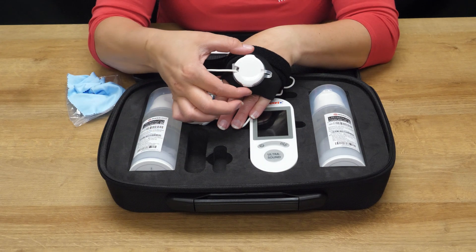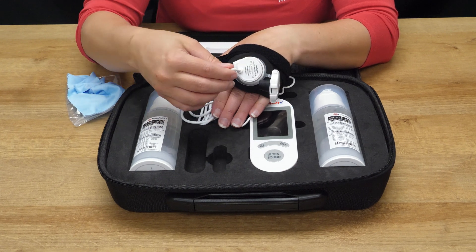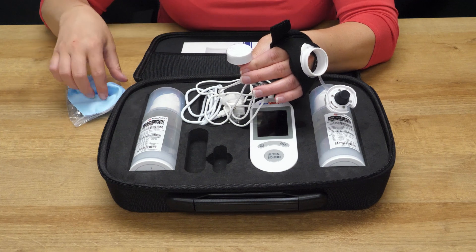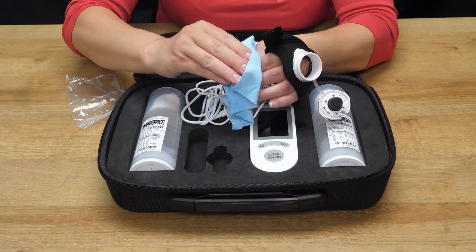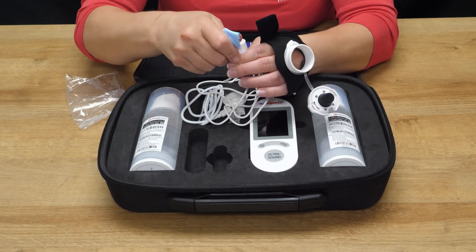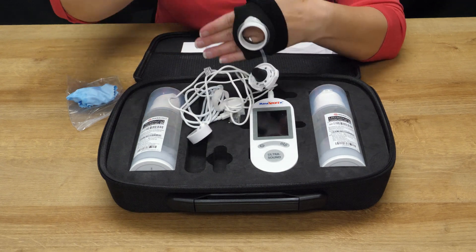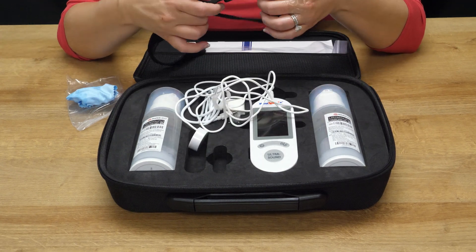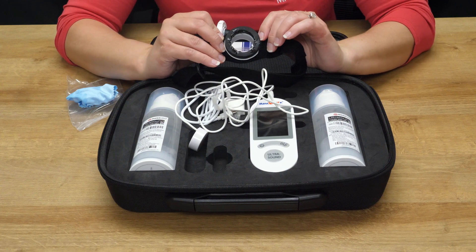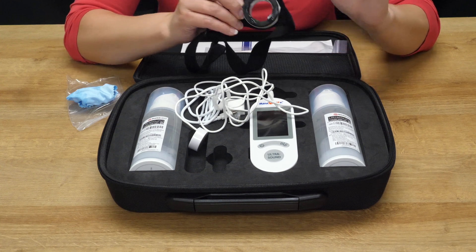Once treatment is complete, press the buttons on your cap and pull it open. Pull out the transducer — you will have remaining gel. Take your blue cleaning cloth and wipe down any excess gel, drying your transducer. Once that's complete, pull your strap off. Make sure to clean the bottom side — you can use a paper towel or anything you have nearby to wipe that down.